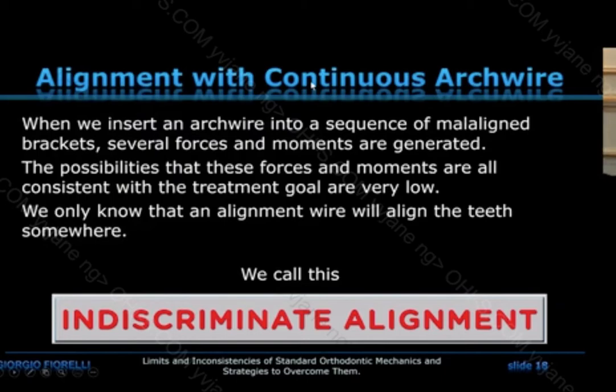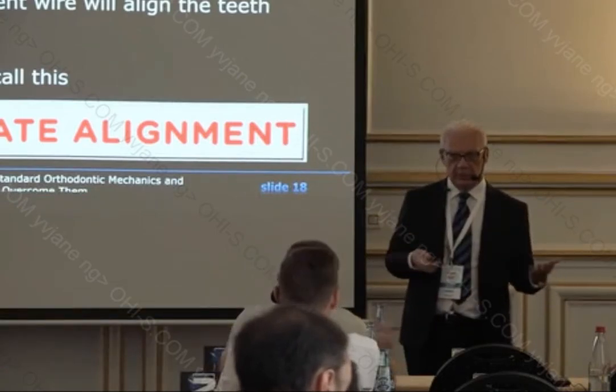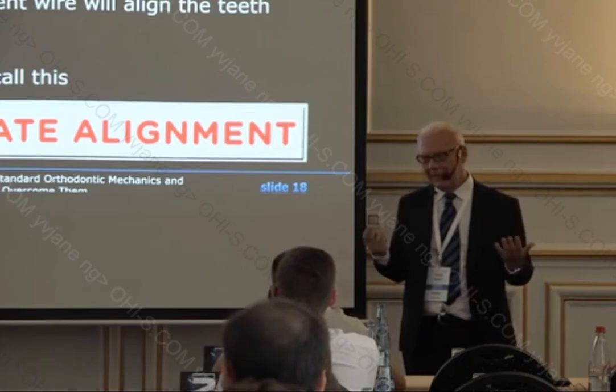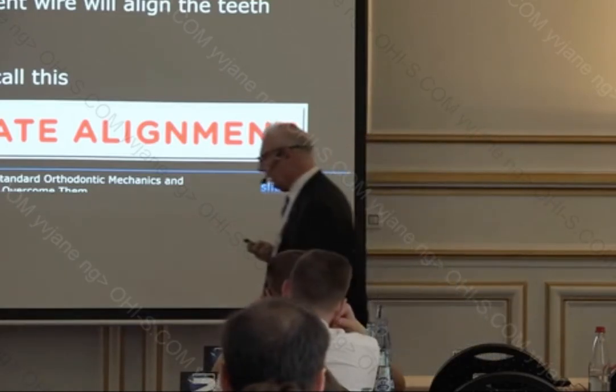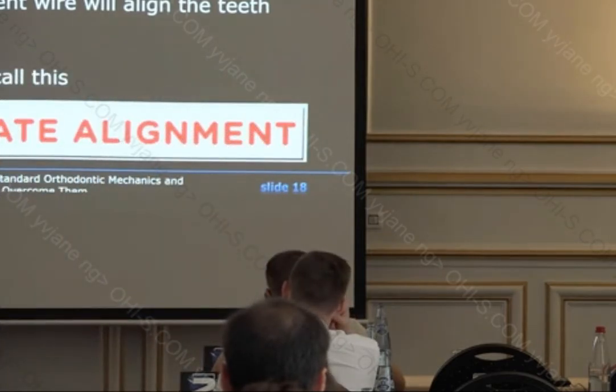And I would say that orthodontists should learn how to make a proper alignment, which doesn't mean that every time you have to open your plastic bag, take out your wire, and place it immediately into the dental arch. If you do that, you might have many times no problem, but sometimes you will have it.